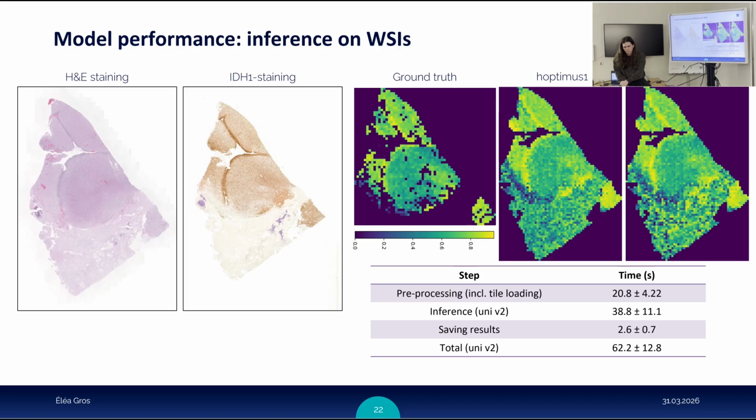Maybe we have to think if we have to find a way to comment on it already from the first submission. And the second part would be, for glioblastoma, as I said, to find a hypercellular high-level tumor area is not difficult, but then you can argue that it can also be used. Now, for example, technicians come to the neuropathologist and say, please annotate the slide for me, which takes time. If it's an automated thing that runs in the lab and the technician can put a slide in by himself, see the tumor cell content, and do a biopsy in this area, I don't have to go to the doctor anymore, we save time and so on. This would be an argument for the glioblastomas, for example.